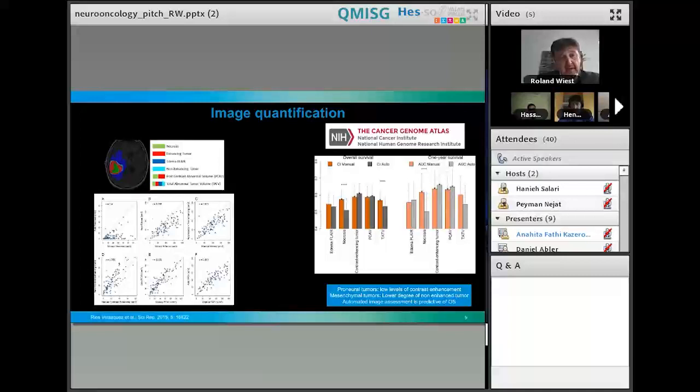And if you dig back a little bit in history, this is from a paper that we had some 6 years ago, then we could show that the segmentation of the tumors into subcompartments is not only feasible, but it also shows a very nice correlation with expert annotations. And some of you are familiar with these international challenges, the BraTS challenge, and these results get better and better from year to year.